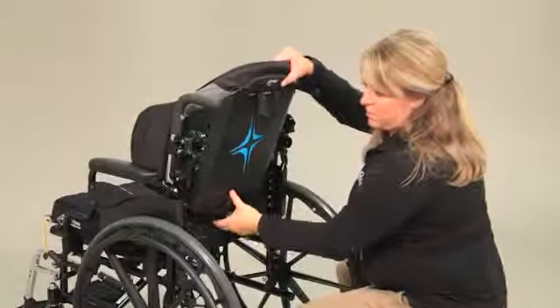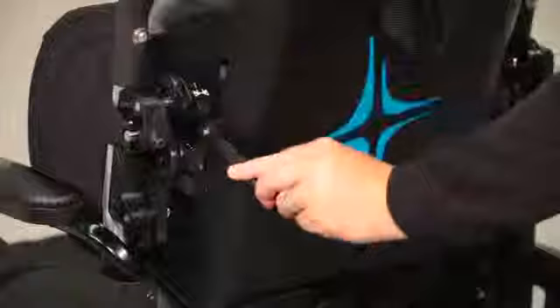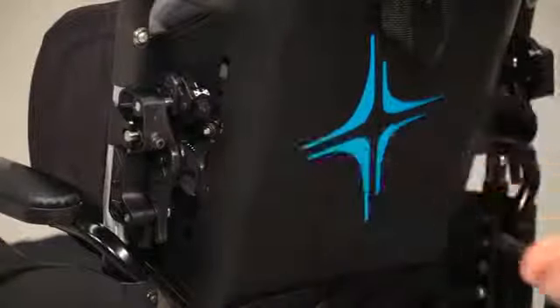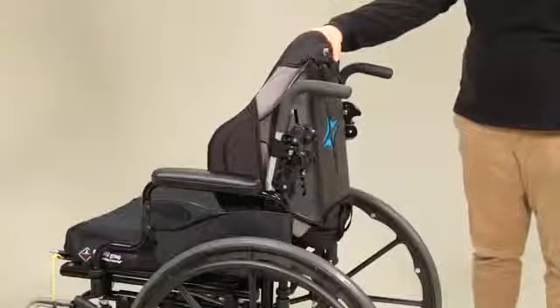The height, depth, and angle can all be adjusted with the client in the chair. Loosen the nuts on the width and height adjustment bolts with the box end wrench. Slide the back shell up and down in the vertical slots until the desired height is achieved. Tighten the nuts on the width and height adjustment bolts with the box end wrench until snug, plus a quarter turn. With the Agility Back System, you can also adjust the depth and angle to ensure the best possible fit.